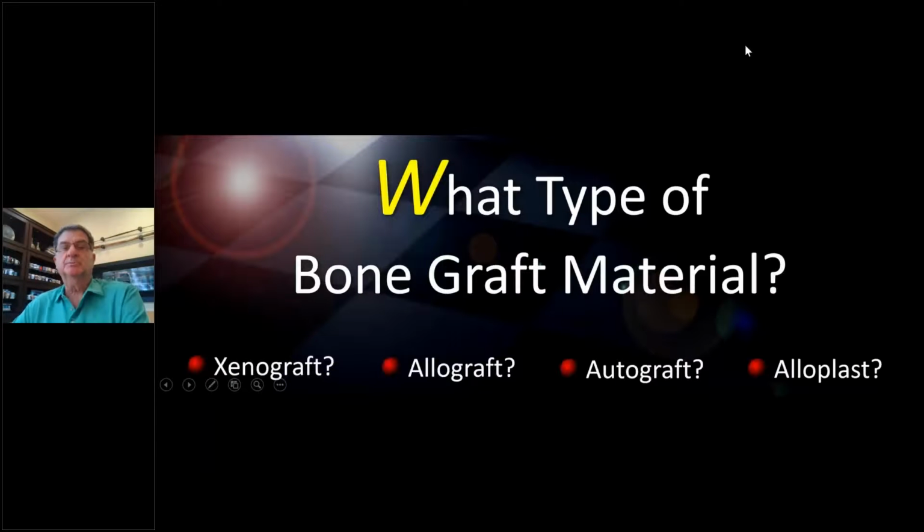Now, what type of graft material is a big question mark? And we're still working on this. It's really a work in progress for a lot of reasons. Elaskary's talking about chips with the big opening. I don't dispute that, especially if he puts something in front of it. But in the soft tissue zone, in the dual zone, I don't want something too thick, because otherwise they become irritating to the tissue. So I want a smaller particle size to thicken the tissue, but where the body can get rid of it, as you'll see. So you can use a xenograft, which I don't mind inside the gap, and use an allograft, autograft, which is autogenous, and alloplast, which is synthetic. And most people use one of these bone graft materials.